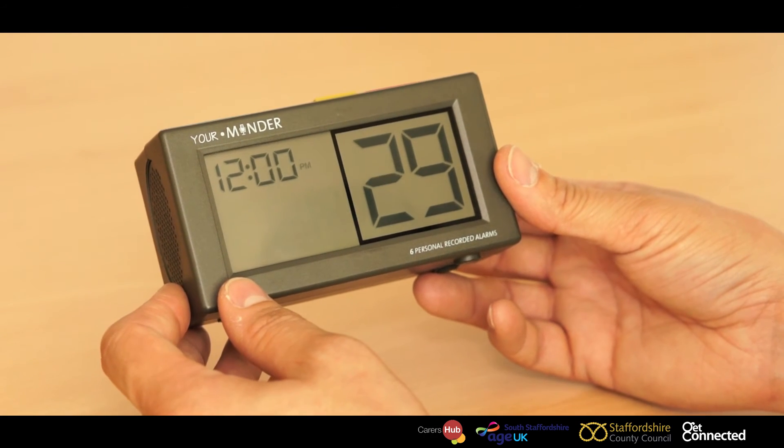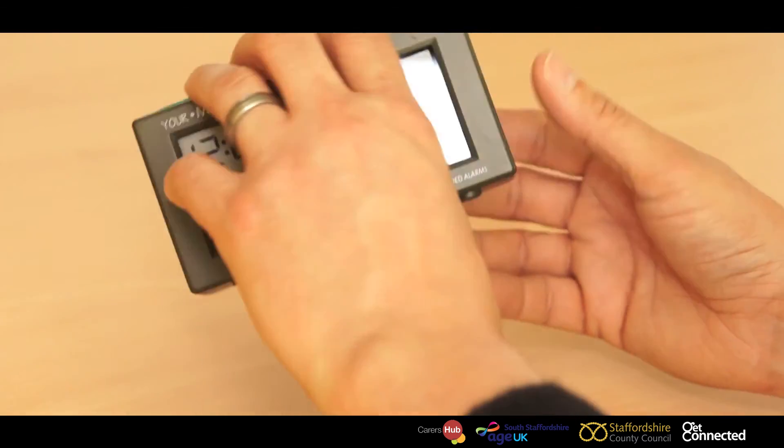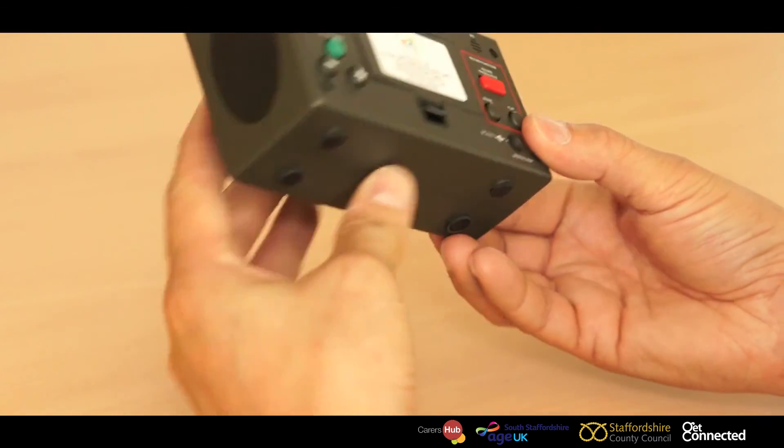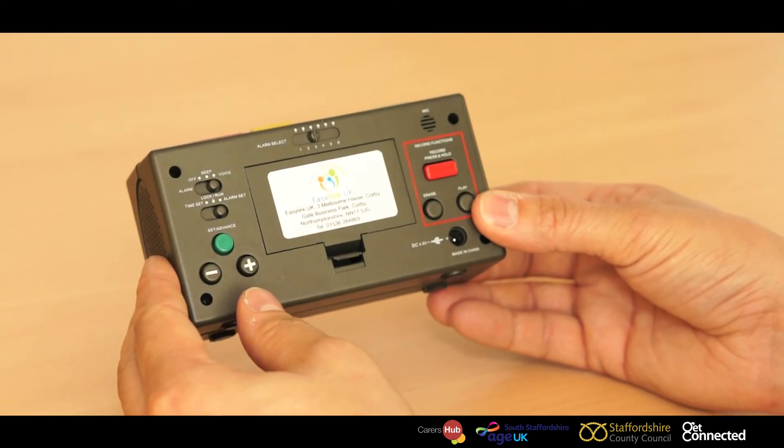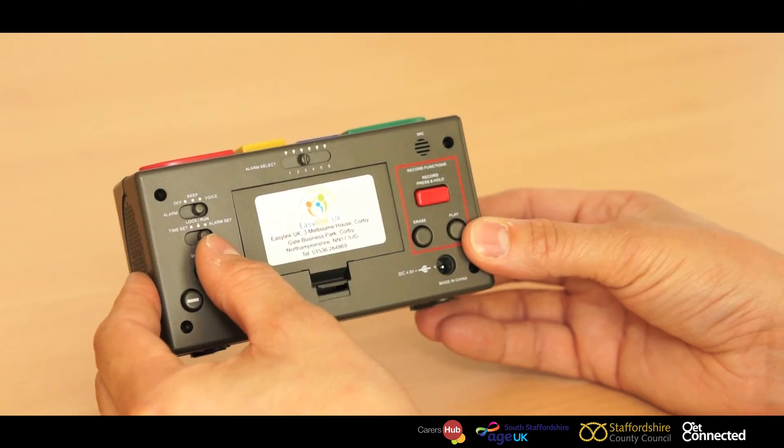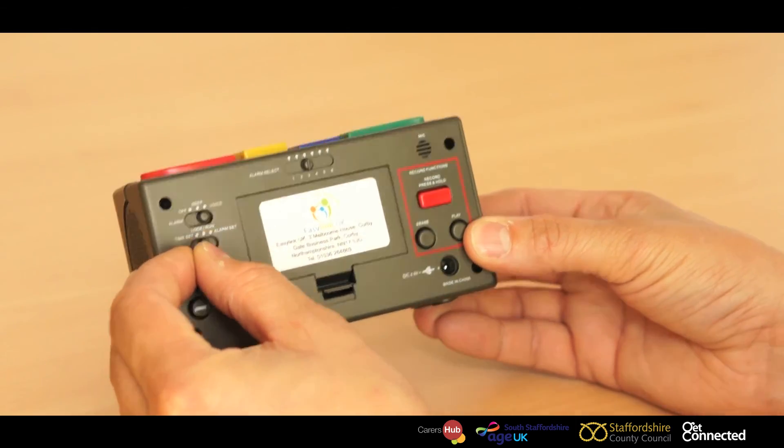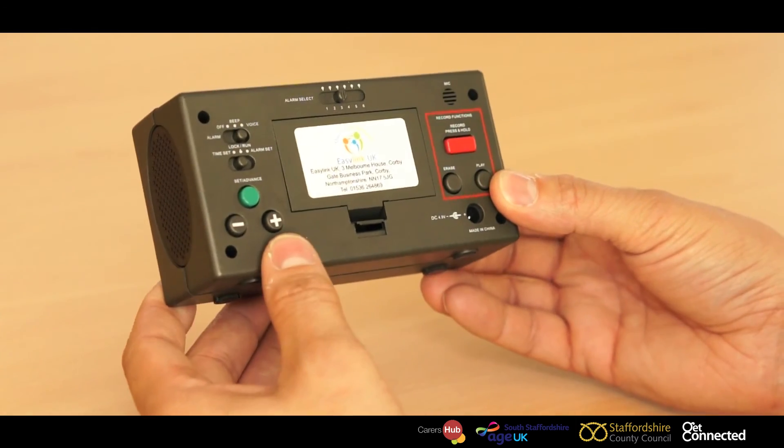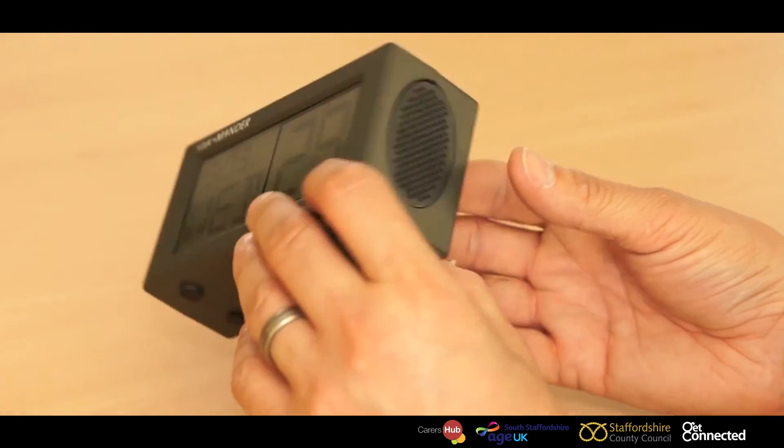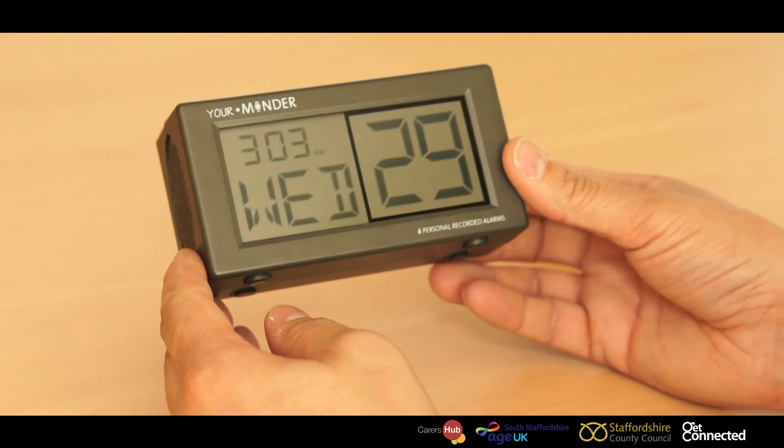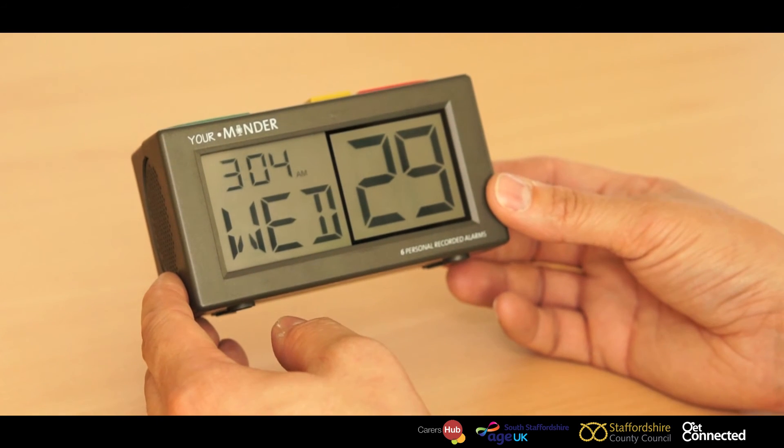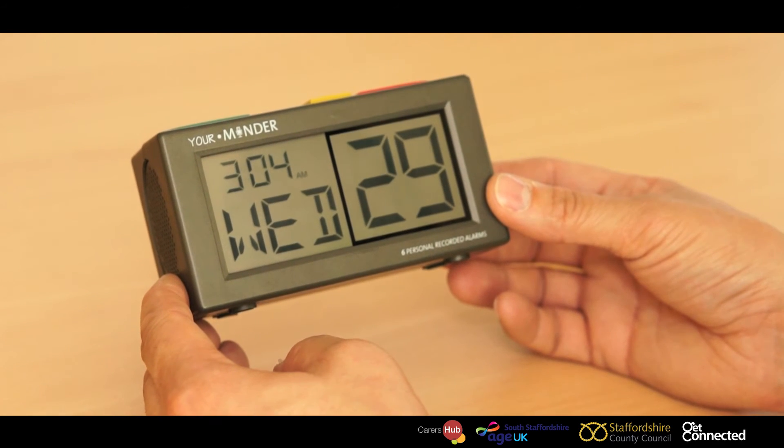Once you're happy that the alarm is set, turn the your minder around and move the switch again into the lock position and now that alert or alarm prompt is now stored and set on the your minder.